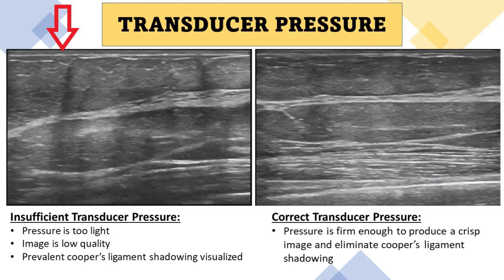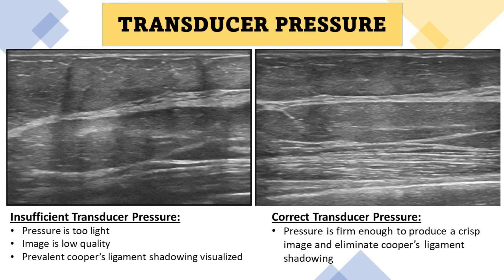In the first image, insufficient transducer pressure is being applied — since the pressure is too light, image quality is low and you can see lots of Cooper's ligament shadowing throughout the image. In the next image, the correct transducer pressure is being applied; the pressure is firm enough to produce a crisp, high-resolution image and also eliminate Cooper's ligament shadowing. One of the most important things I tell new sonographers is: don't be afraid to push. The patient is there to get a high quality diagnostic study, and you want to make sure you're doing everything you can to get the best images.